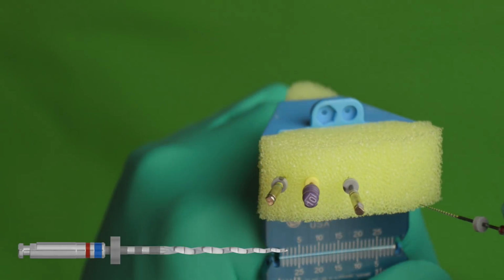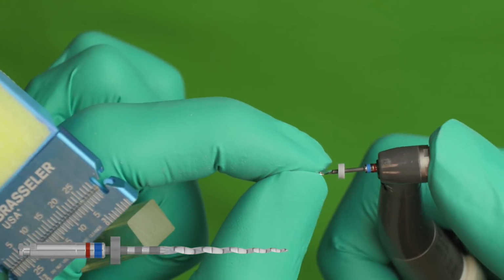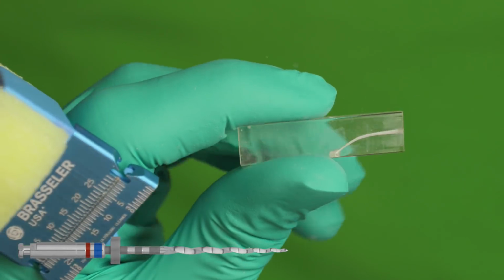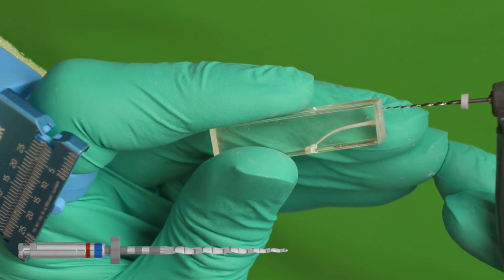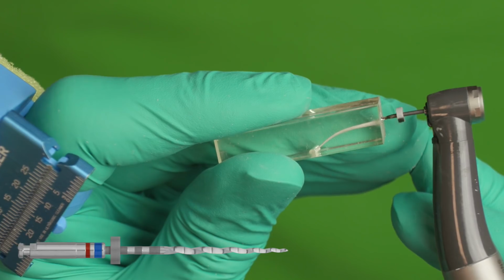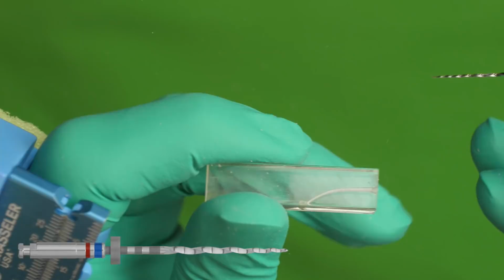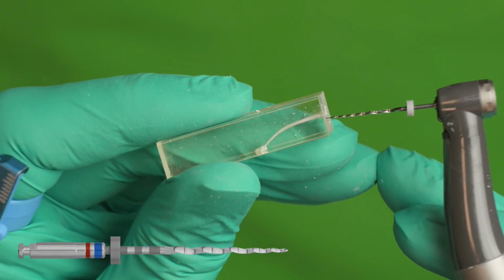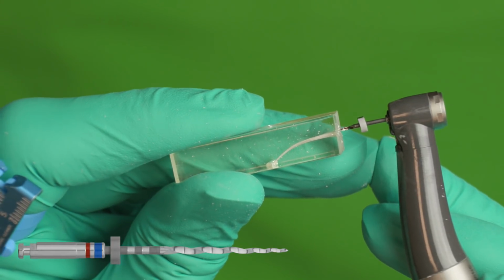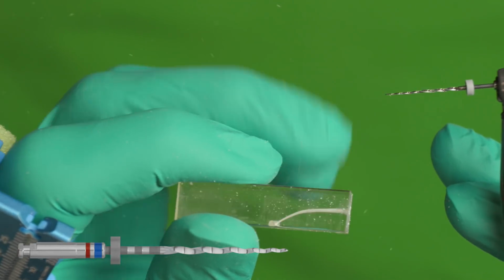So the goal now is to use the size 30 with the rhythm motion and see how far it goes down the canal, and then go from there. So we're going to get this started. Start the motion. We get 1, 2, 3. So we have some cutting going on here, and the chip space is full, and we would be cleaning it usually using the endo swipe. Clinically, your assistant would be doing that, and you can see that each time the instrument is advancing a little bit more in the canal.